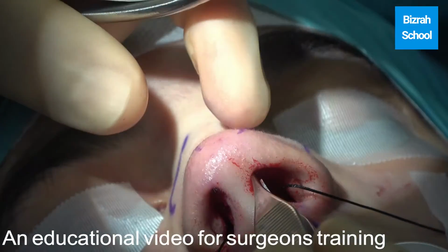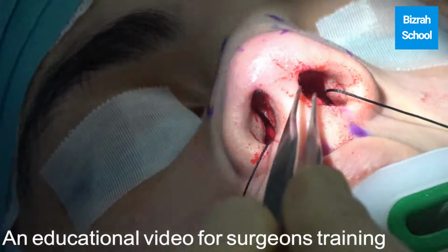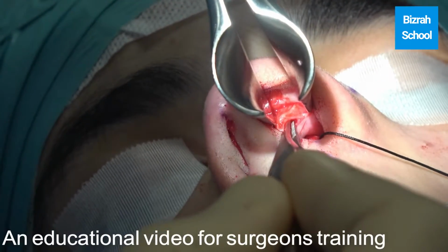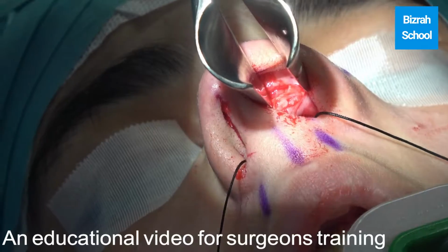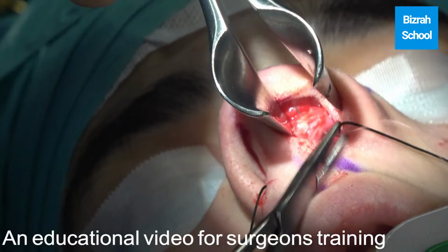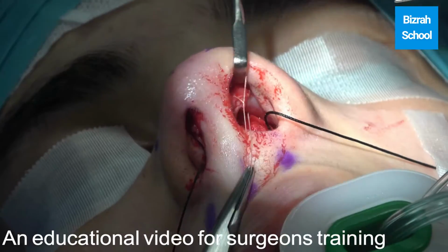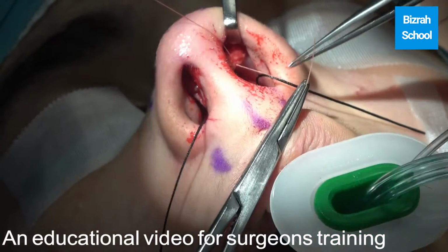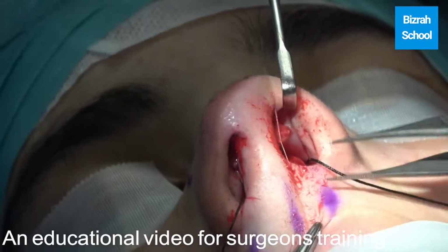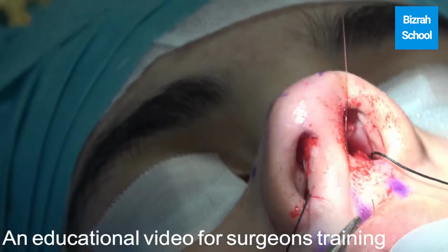And this will give me more fullness here, more fullness outside, and give me more symmetry between the two sides. Okay, because the patient's nose is severely deviated to the right side, so we put the spreader graft on the left, and we just make a suture. Fix it, make sure it doesn't go out. Well, this is the easiest and the quickest way for a spreader graft. And it's safer, more secure. The graft will go straight to the right pocket. And if you need to do it on both sides, you can do the same on the other side.